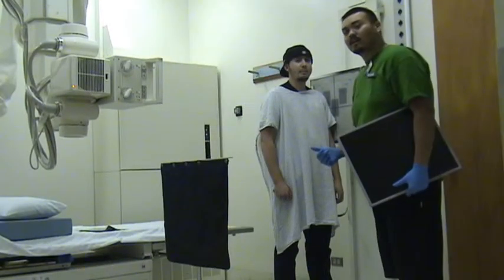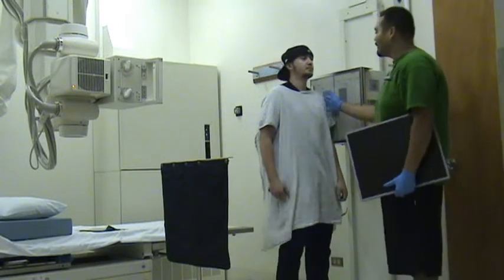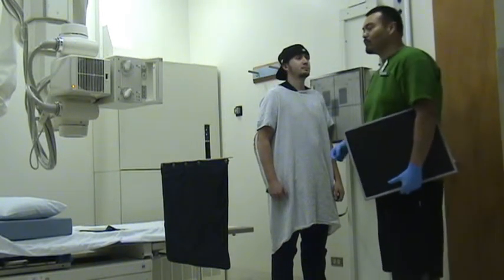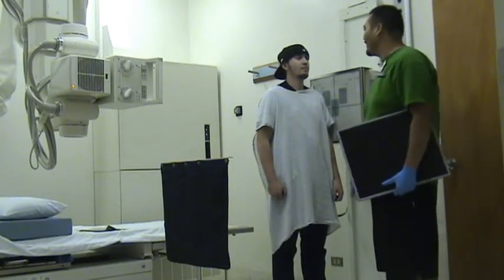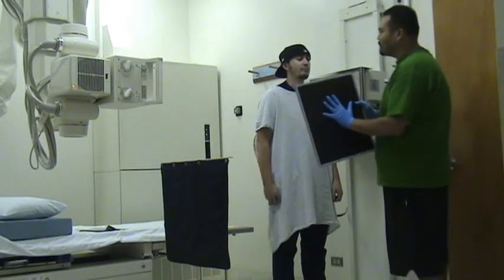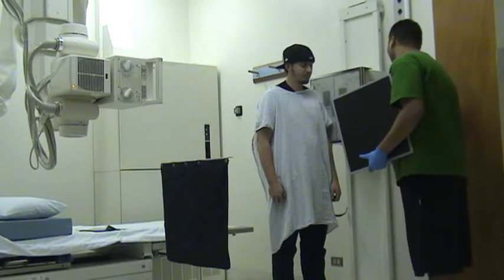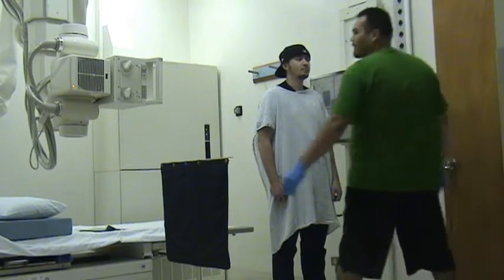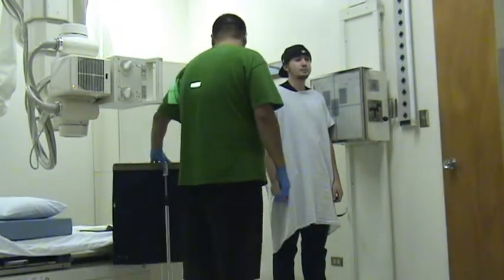Alright, so our second shot is going to be a left lateral shot, which you have your patient facing you. The left side is closest to the board, and the x-ray beam will be coming in at a transthoracic, I guess, way from the right side to the left. So for him, we're going to do a portrait view. You adjust it, slide it in. Adjust your beam as well, so you have him.